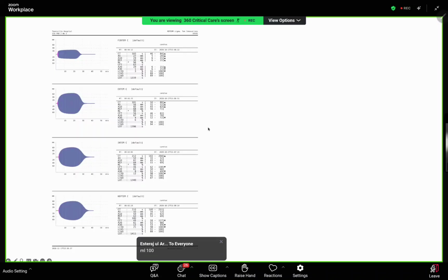Quick, quick. What is this one? This one. Somebody has pointed. What does that mean? 100%. So again, fibrinolysis. How will you treat this? Any answer? Tranexamic acid. Right, correct.